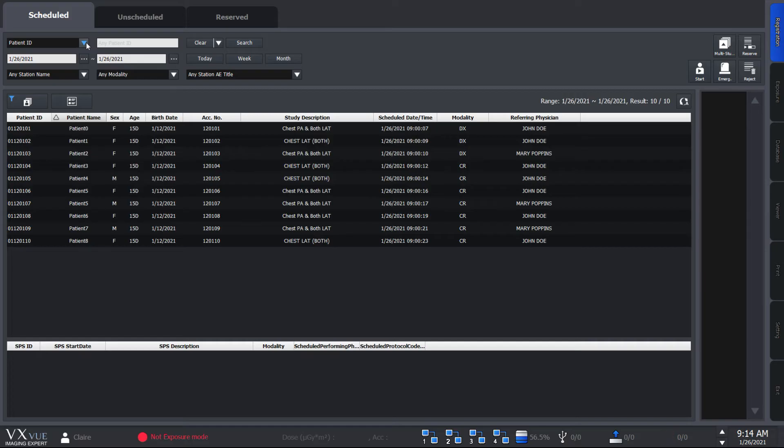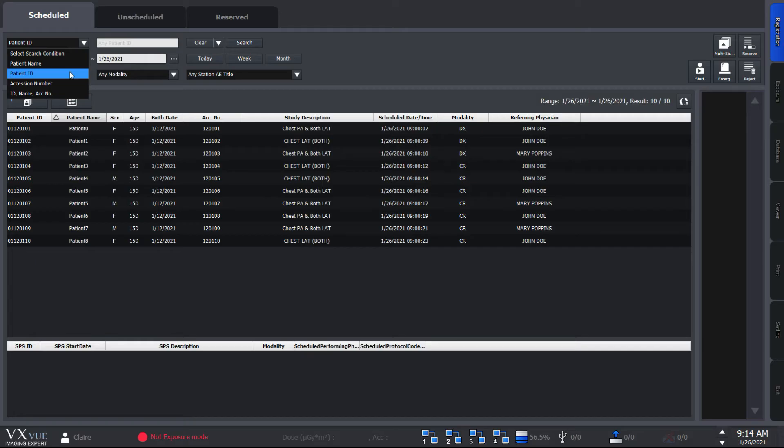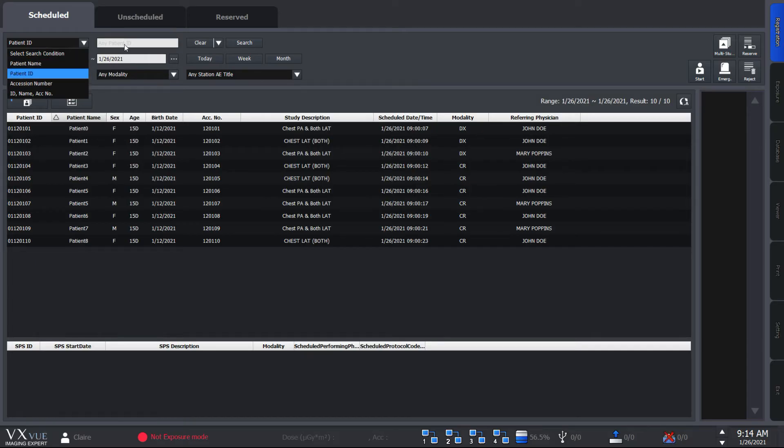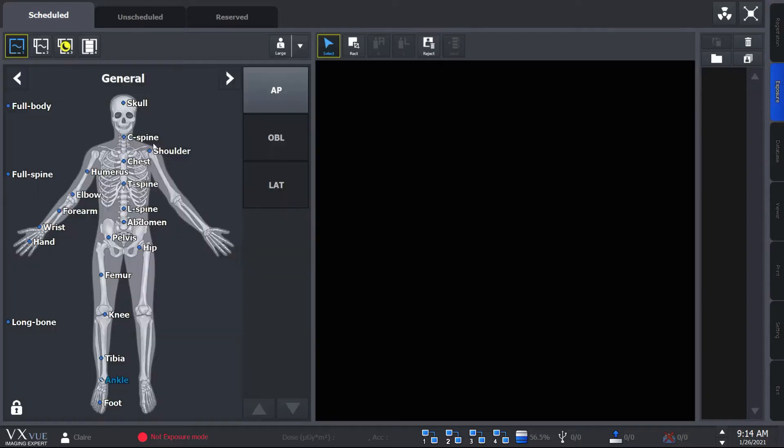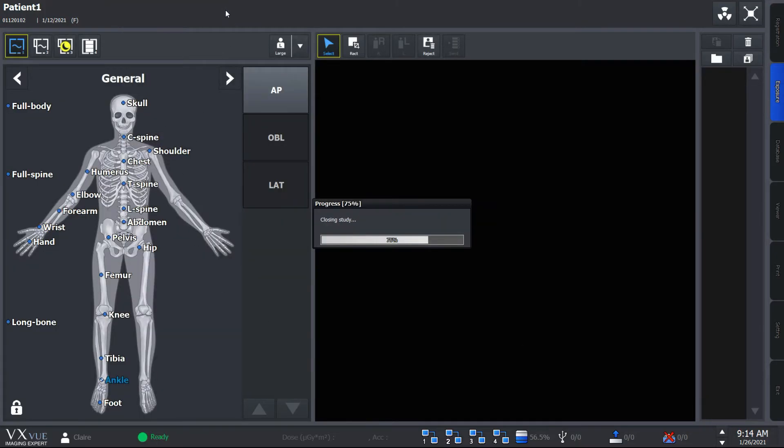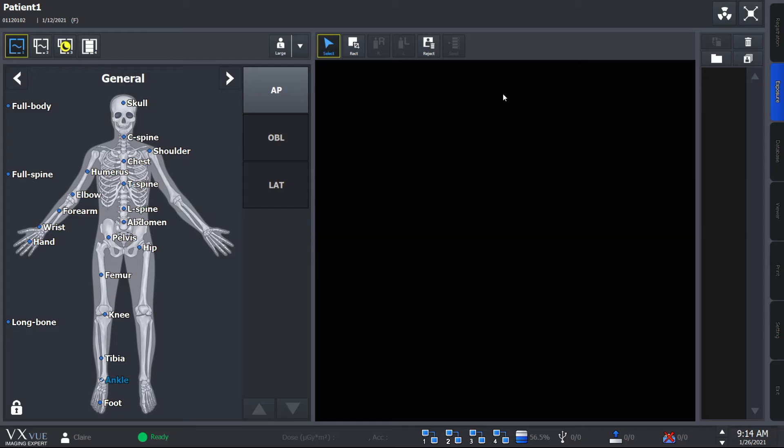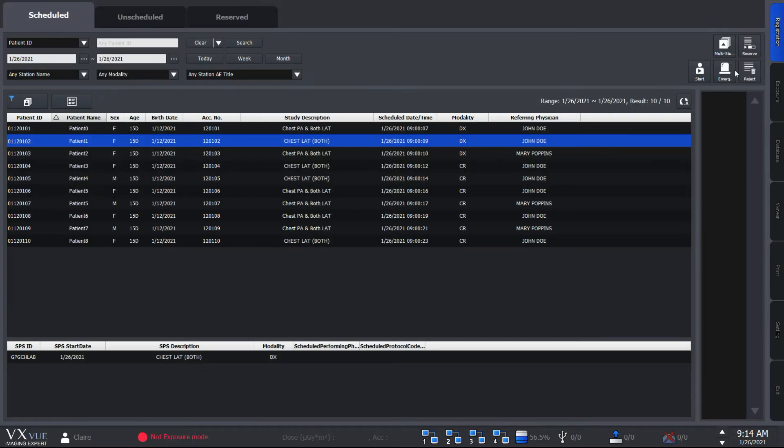You would also have situations in which you want to search for a specific patient and you can do this by searching the patient ID, name, or session number here. Double click on the patient to go to the exposure mode. I'll skip this part for now because there will be a separate video on this. So this is it for the scheduled panel.